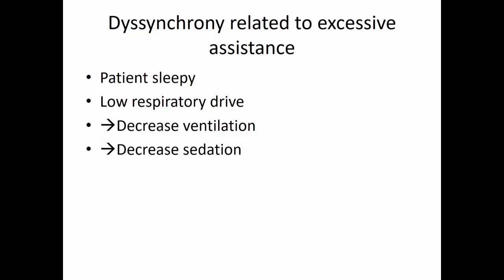Don't think that the patient is fighting or struggling. In fact, those patients very often look sleepy, and they have a low respiratory drive. That's why when you have an asynchrony with a low respiratory drive, you have to try to increase this drive by either decreasing ventilation or decreasing sedation.